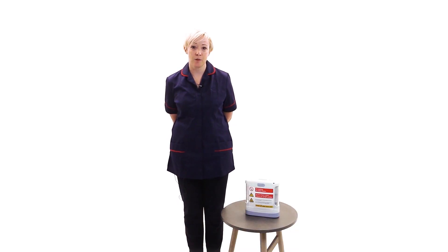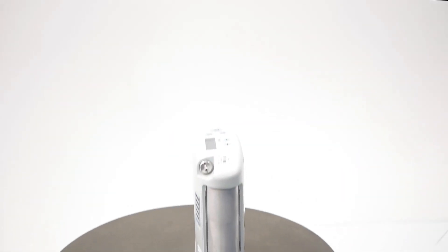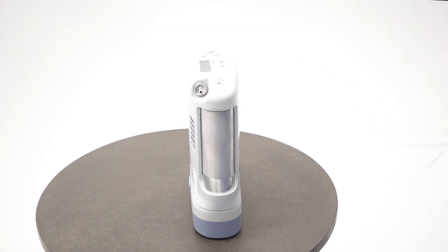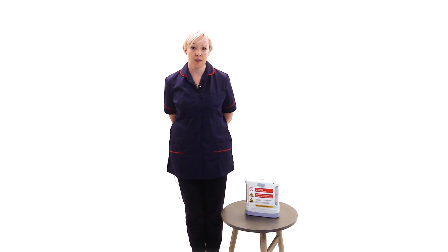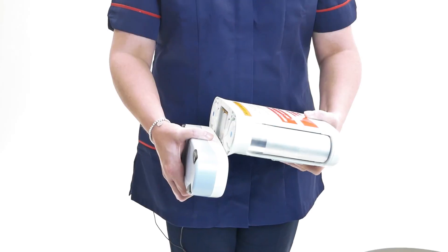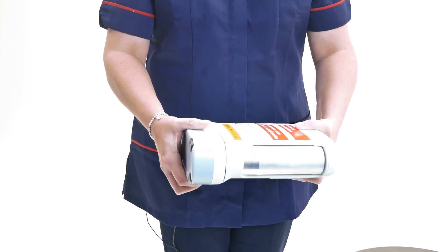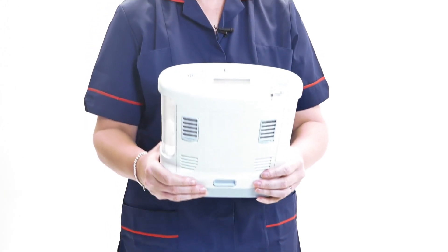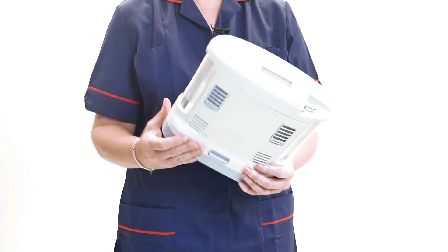I will now demonstrate how to use your portable concentrator. Place your device in a well ventilated location so the intake and exhaust vents are clear and unobstructed. Ensure that both the intake particle filters, those with the blue plastic surround, are clean and correctly installed. Ensure that the battery is installed by sliding it into place at the bottom of the device until an audible click is heard and the latch securing the battery to the device returns to the upper position.